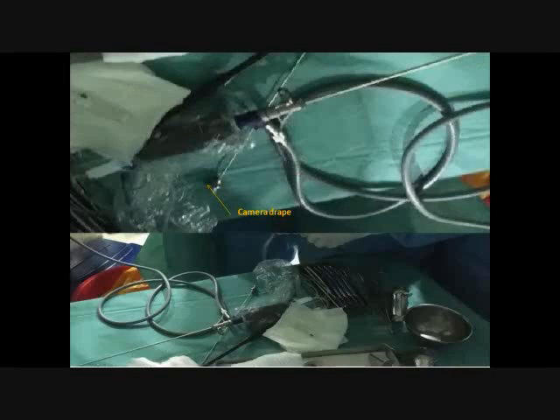In the operating room, we use a camera drape to be able to work with it since the camera can't be sterilized. And sure, we can do it without anesthesia, but for the record, it's always good for beginners to start under anesthesia. This way, they can improve their dexterity while providing comfort to the patient.